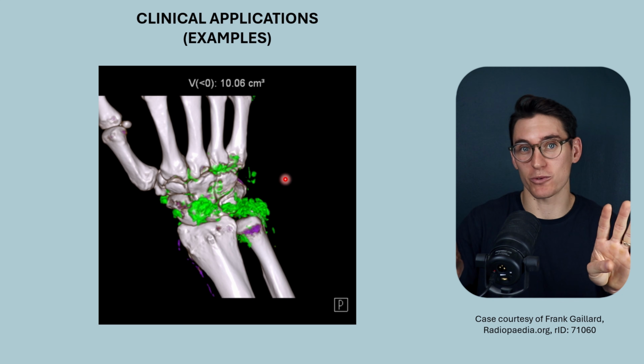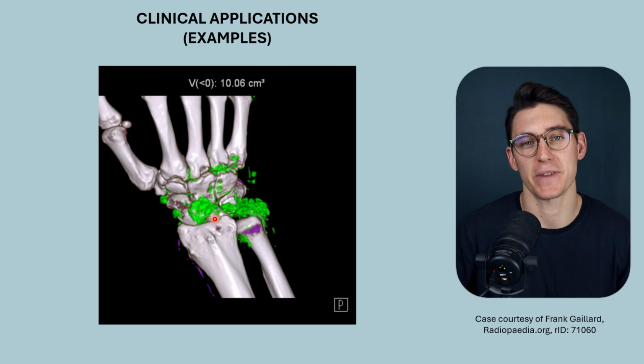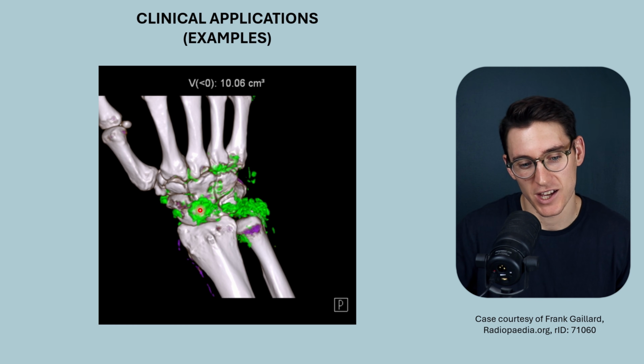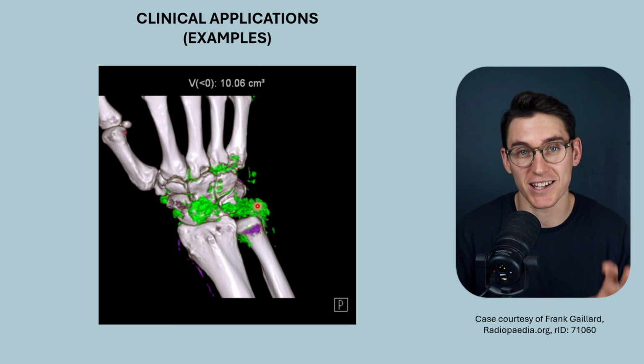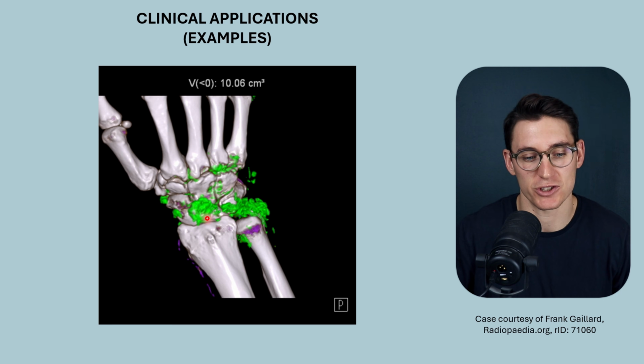This is really useful. We can monitor response to treatment, say, and see an actual visual reduction in monosodium urate crystals. You can see that we've allocated a specific color to those pixels here, a green color, to separate visually out those tissues.